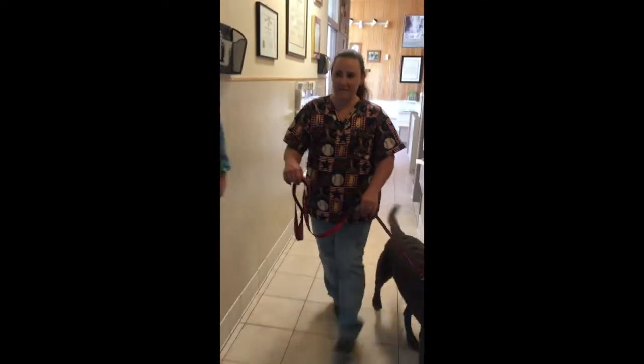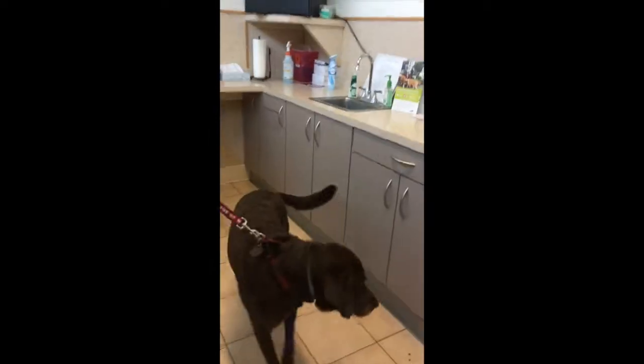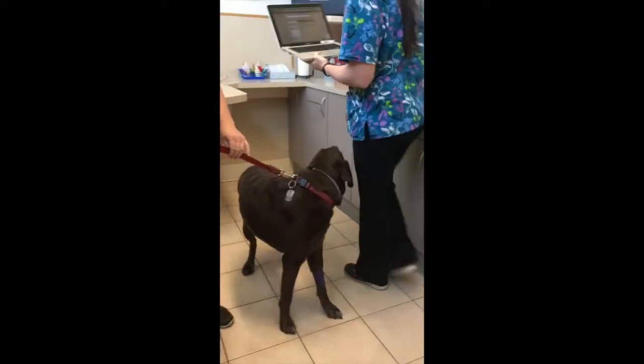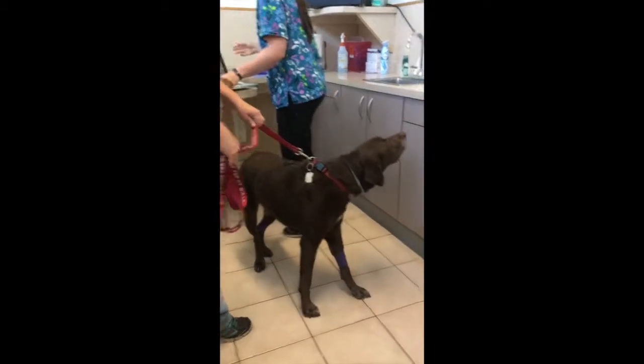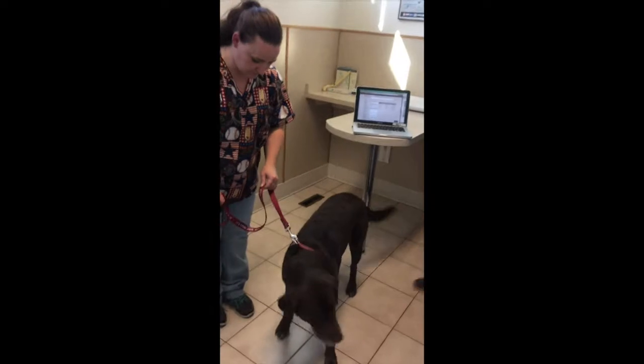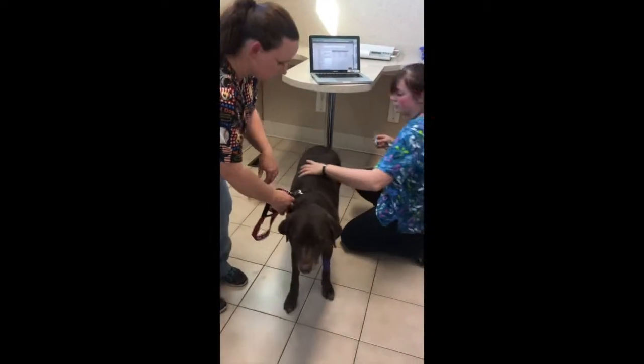All right, then we're going to come down here into an exam room. Come on, Ruger. Good boy. So now that we're in the exam room, I'm going to get a temperature on him, and I'm going to listen to his lungs, and give him a look over from tip of nose to tip of tail. So first thing I'm going to do is get a temperature.